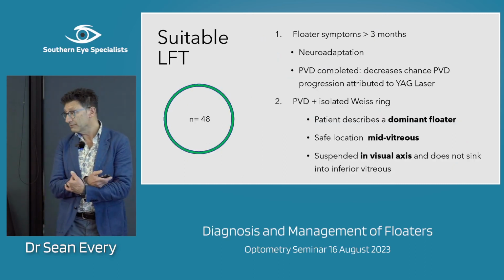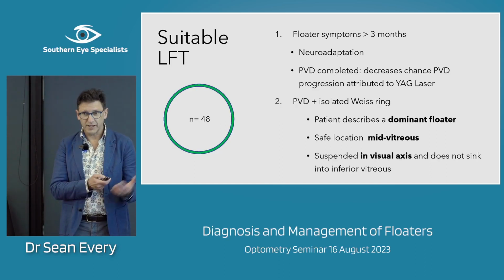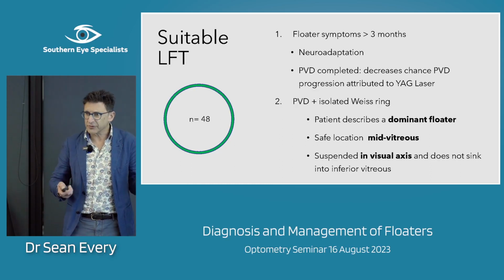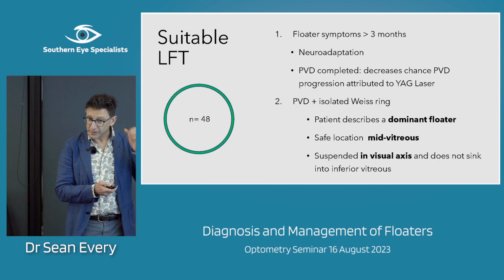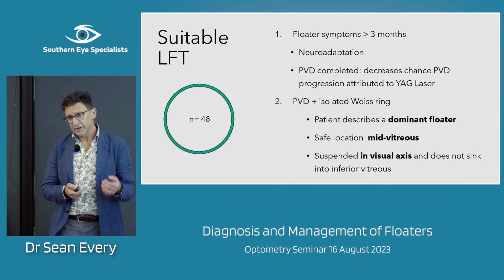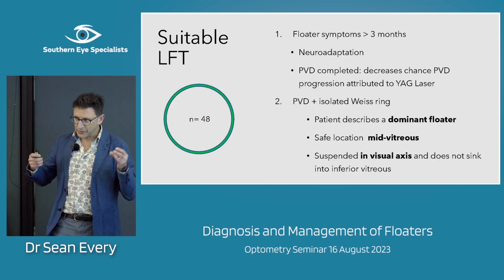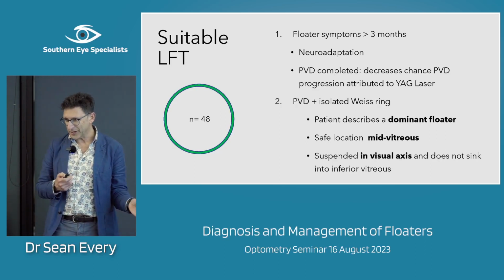So who's suitable for laser treatment? Well, as I say, I feel they have to have been symptomatic for over 3 months. It's the right thing to do to give them that period of time to neuroadapt. There's no point doing procedures for symptoms that are just going to settle down. And the other reason for waiting 3 months is that in the vast majority of people when that PVD process happens, it's just a one-off event, and 100% of the PVD happens straight away.